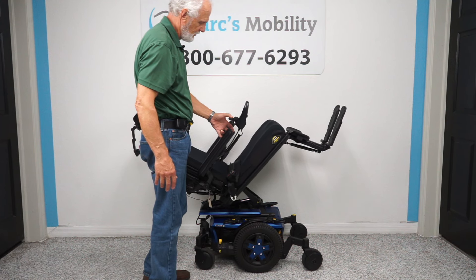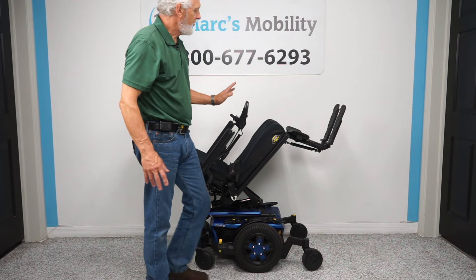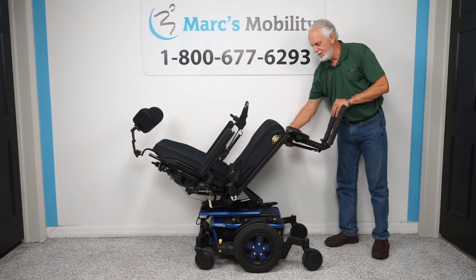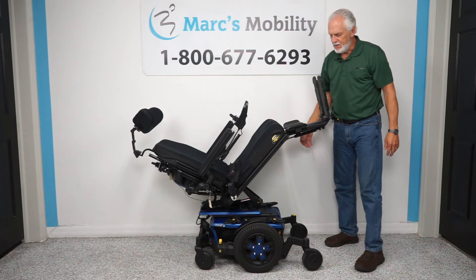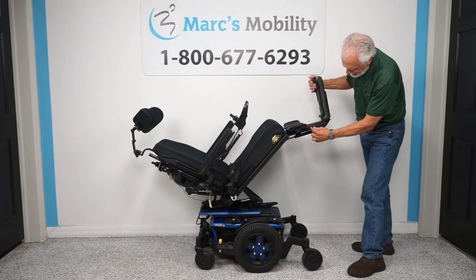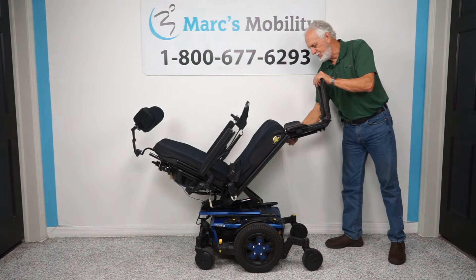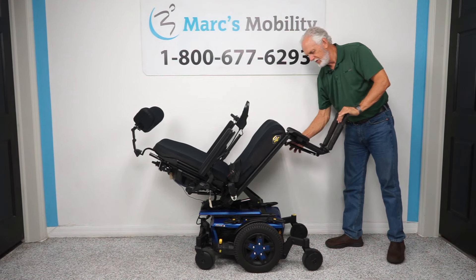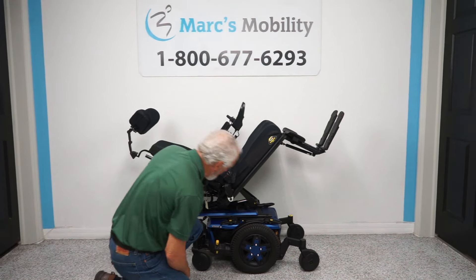The chair is matte blue, which is the newest color they came out with. The legs are manual — there's a lever on this side and if you push it down you can raise the legs higher. These legs are adjustable; there are two screws here and we can move the foot plates in and out. This is the electric tilt while the chair is tilted up.